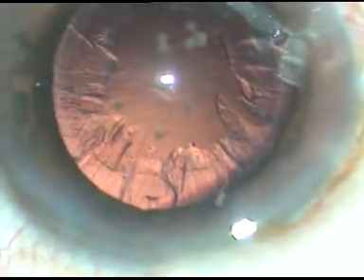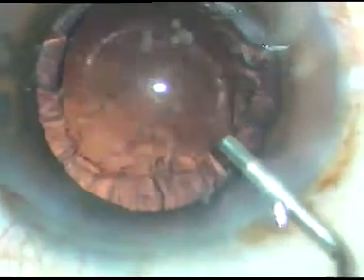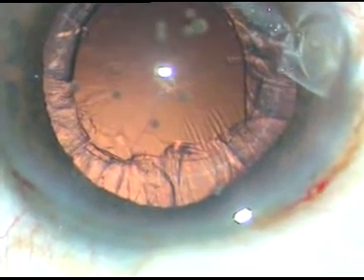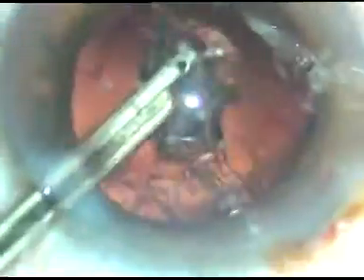Now we can see a very nice red reflex in this case. Viscoelastic substance is injected, and now I am going to use a 23-gauge Simcoe cannula to remove the cortical matter. It is very easy to remove the cortical lens matter with a Simcoe cannula, or you can use bi-manual IA — it's a matter of practice, whatever you practice a lot. Now I am going through the side port to remove the cortex from the sub-incisional area.